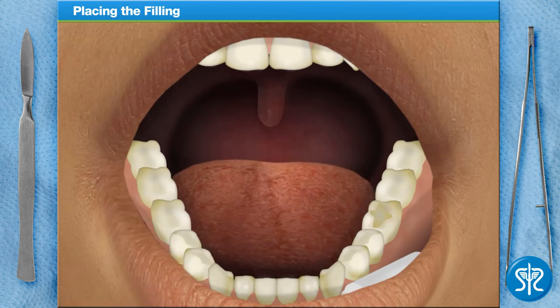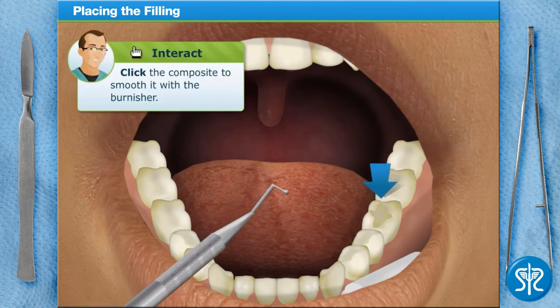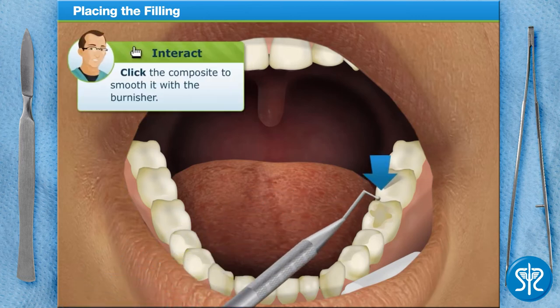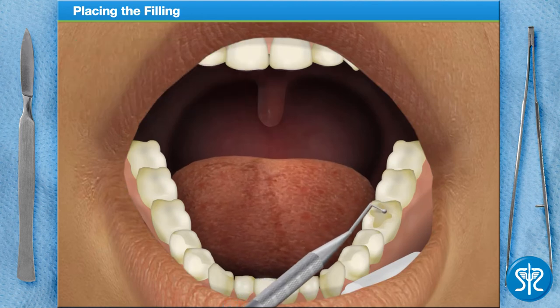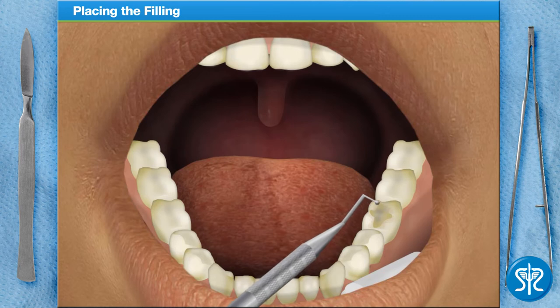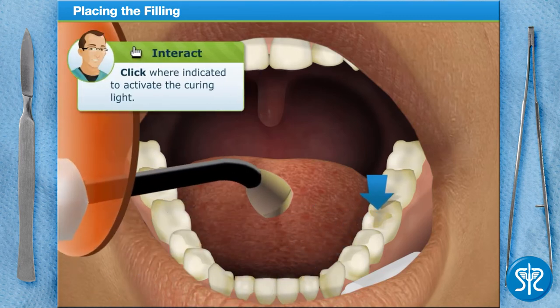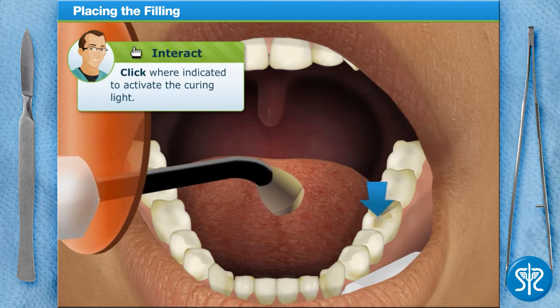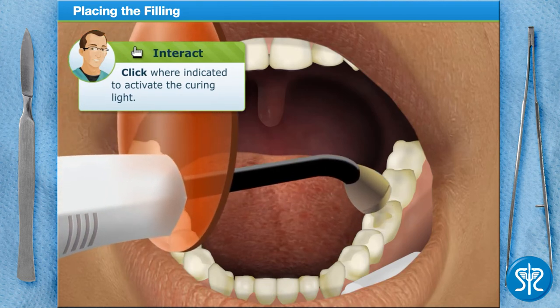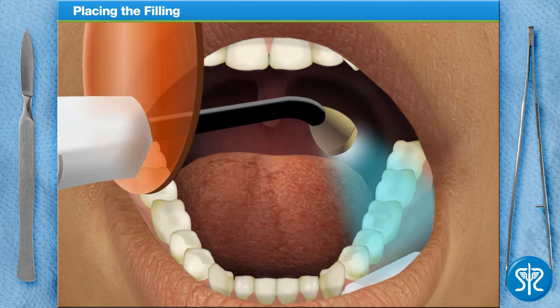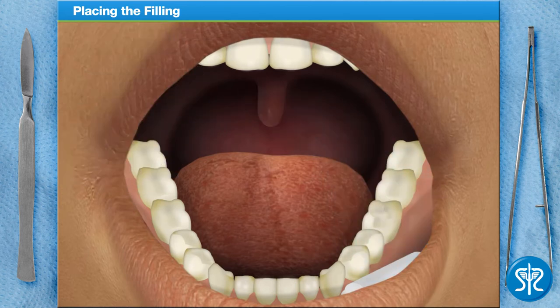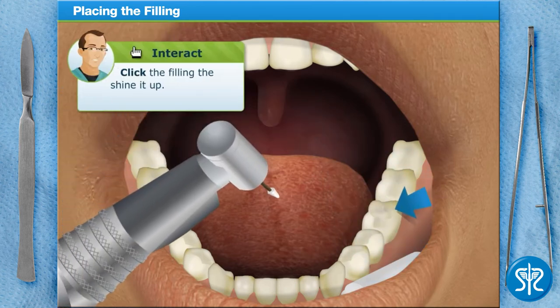Next, you'll need to smooth the filling using an instrument called a burnisher. Then place the curing light over the tooth and activate it to harden the material. Finally, polish the filling using the polishing instrument.